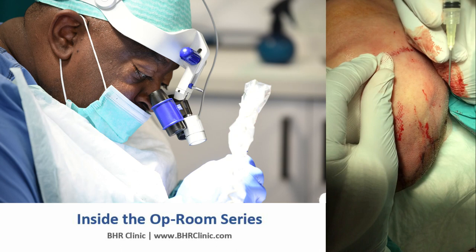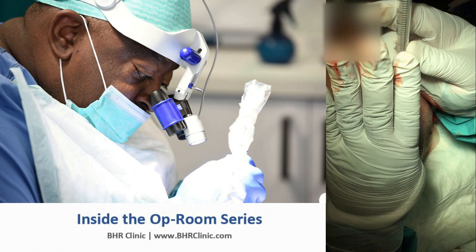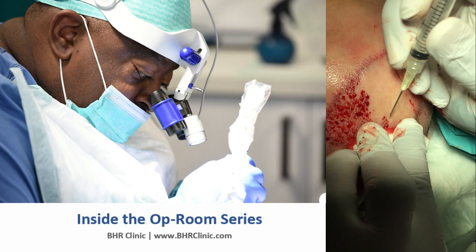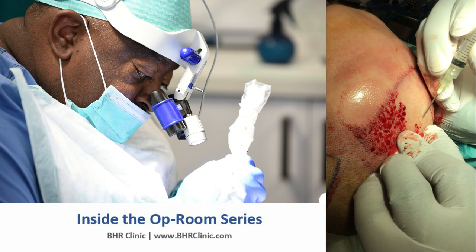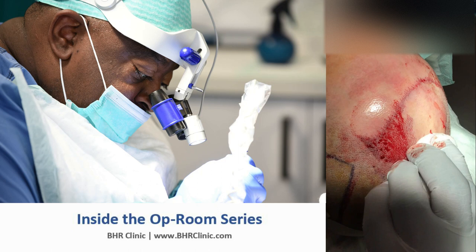The illusion of coverage in hair transplants depends on the angulation of the incision. If you make the incision at almost 90 degrees, the hair will be standing up and won't provide coverage. But if you make the incision laying flat, parallel to the existing hair shaft, you get better coverage and a better illusion of coverage, because light will not penetrate and reflect upon the scalp.